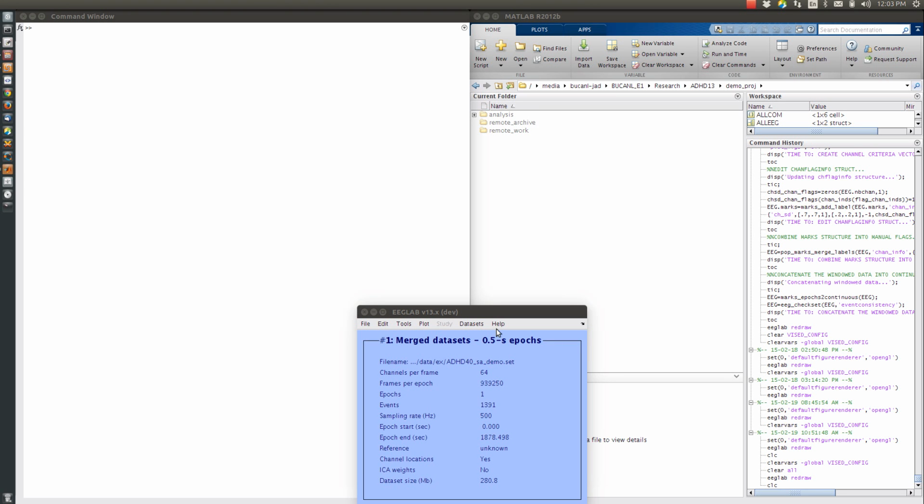So in this demonstration, we're going to be talking about the software tools for transitioning from a local workstation use of EEGLAB onto a high-performance computing cluster and the efficiencies that come with that. But it's also important to think about if these tools are designed properly, they will house the framework for developing a repository of shared and co-developed optimized procedures that can be used across labs for neuroscience research.